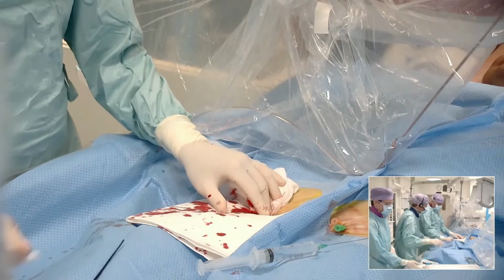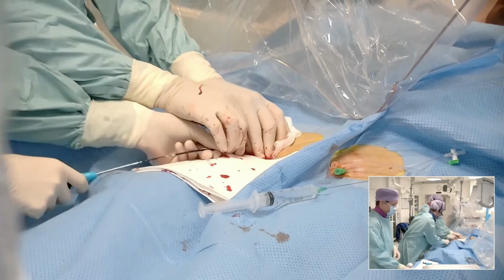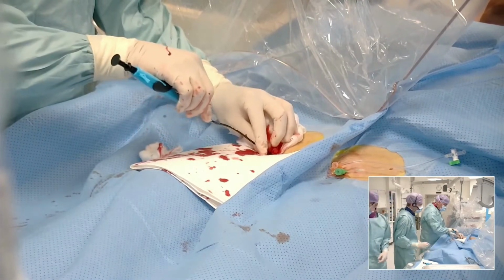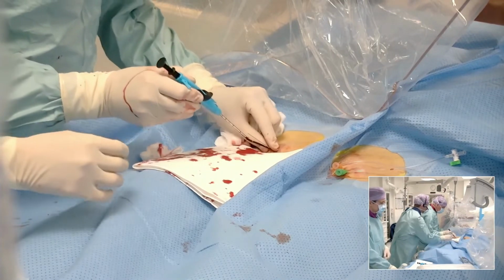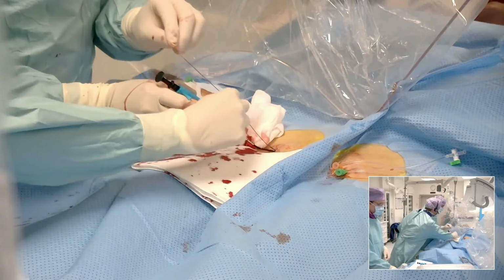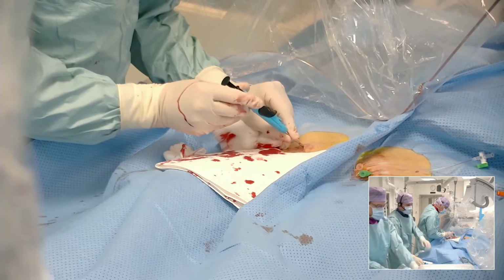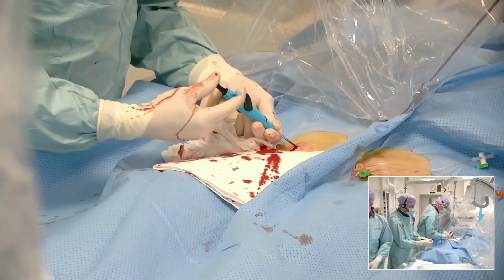And then we're going to use the next generation of the ProGlide. This is called the ProStyle, and maybe you can say a few words about this iteration, Ole. Yes, so it's rather similar for people used to the ProGlide, but on this ProStyle, I would say there are a few new iterations.